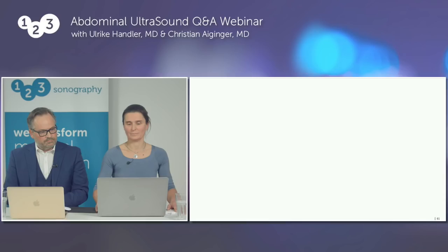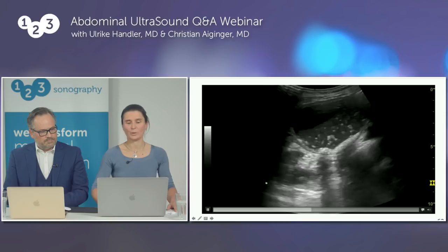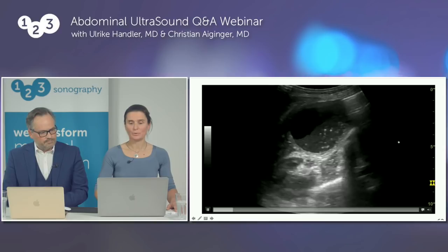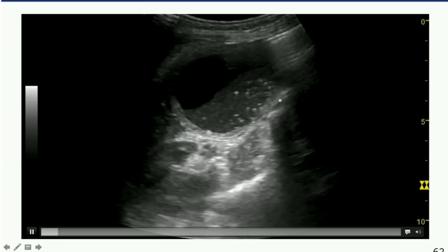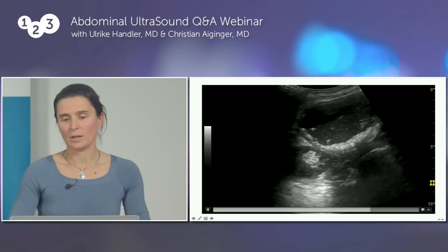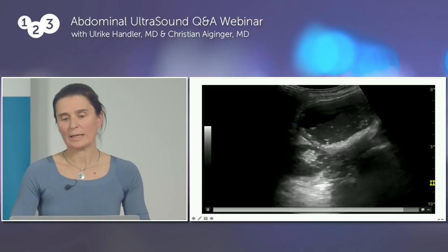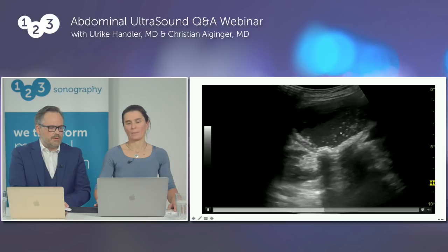Here is another example of acute cholecystitis — this is certainly painful to the patient when palpated. We see this enlarged organ, the gallbladder filled with sludge and many small gallstones, with distinct layering of the gallbladder wall — definitely thickened, with different layers clearly distinguishable. There may also be pus and gas bubbles produced by bacteria, indicating a very severe inflammation of the gallbladder.